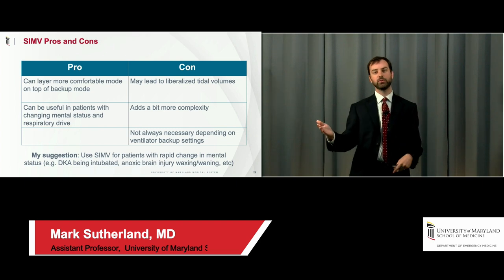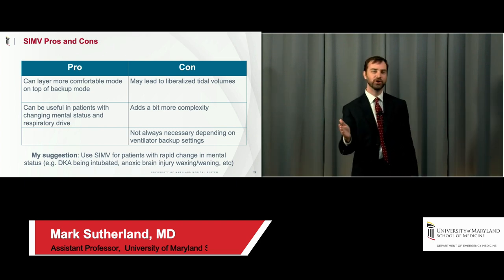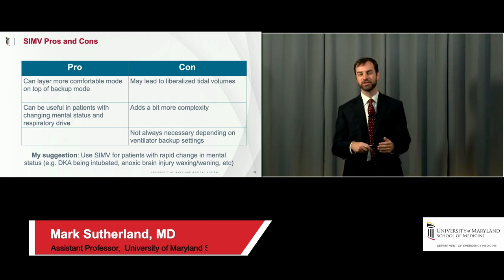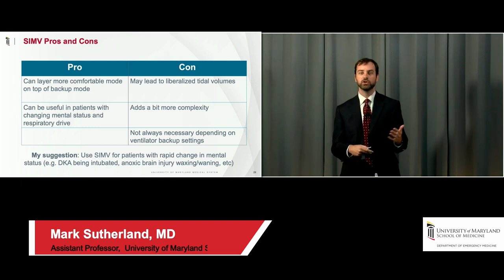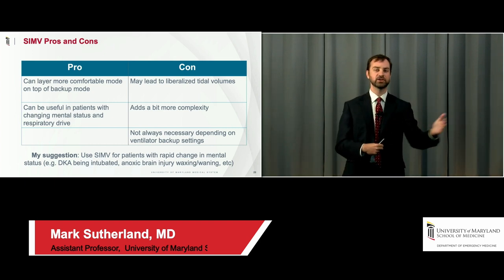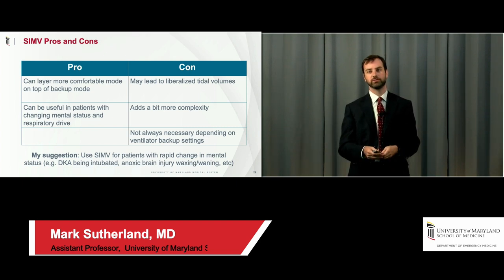The other example, and I'm sure if you all email George Willis, he would love to send you his talk from a few years ago. George gave a great talk talking about DKA, of course, and he was talking about intubating the DKA patient. He went through one way you can use SIMV as essentially delayed sequence intubation to cross-titrate a patient over from pressure support to volume control. So you're going the opposite direction of the anesthesiologist. You're slowly sedating the patient, and SIMV will help you cross-titrate them over from pressure support to volume control.